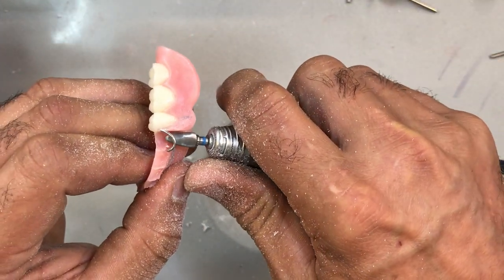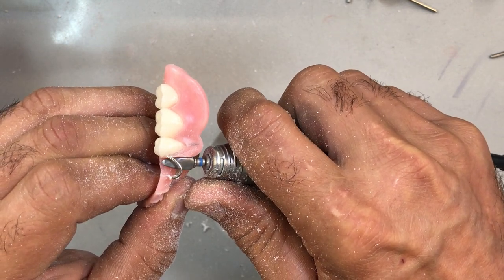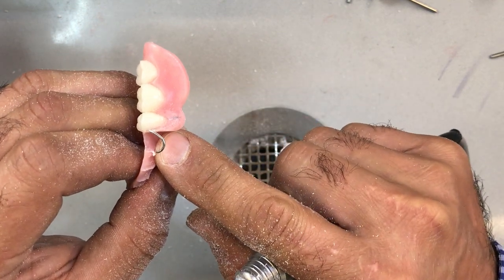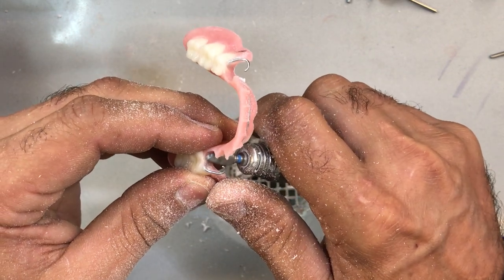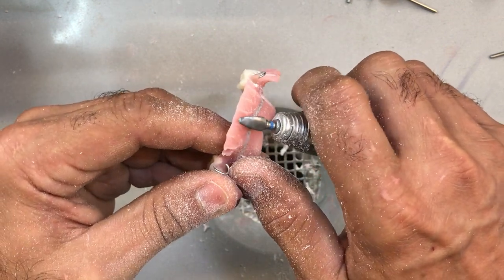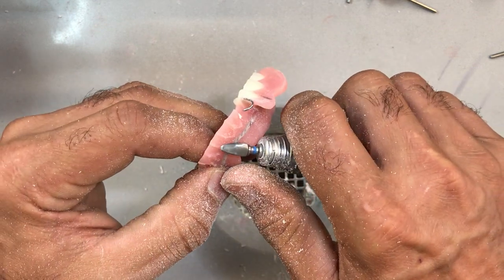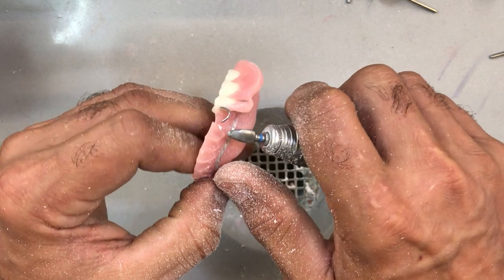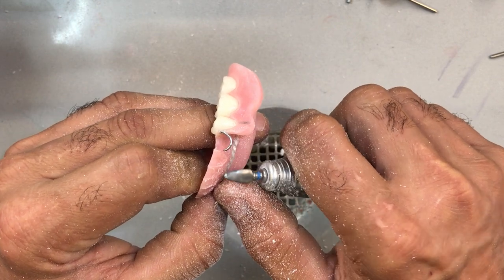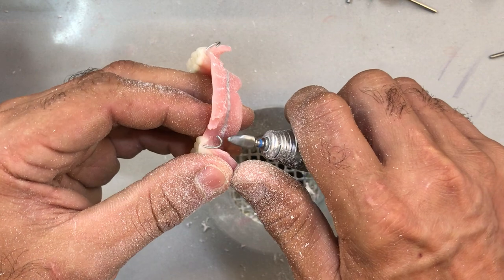I'm getting very close to the top of the apron, but I'm not grinding the top of the apron — otherwise I'm going to create a space. I'm going to eliminate the acrylic from being inside the gingival margin, so I'm going to trim this back a little bit, especially the interproximals. If I get in there a little bit closer I'm going to hit the clasp with this burr, so I'm going to leave it and find a smaller burr to get into that tight space.